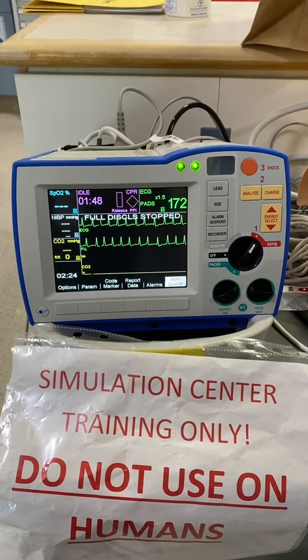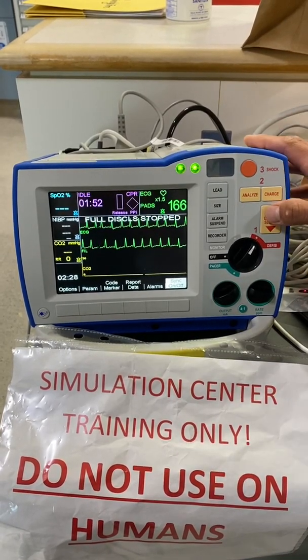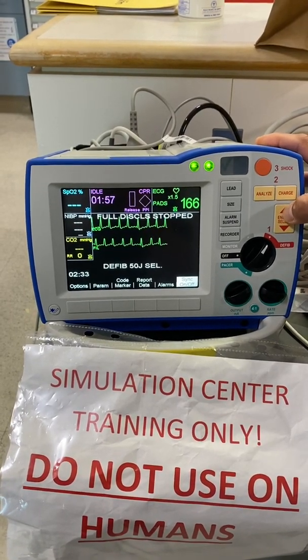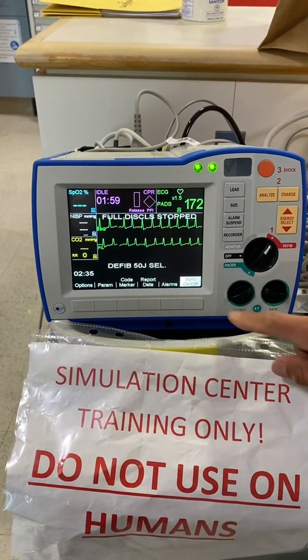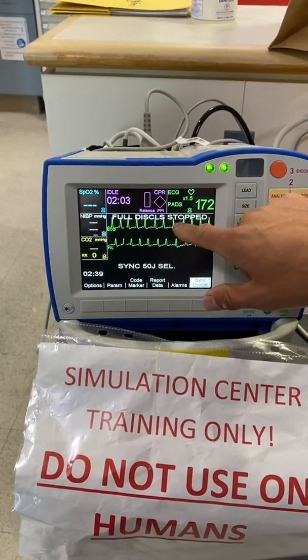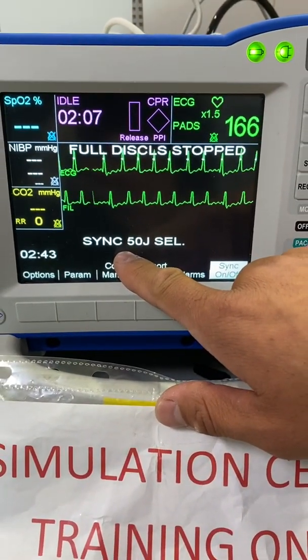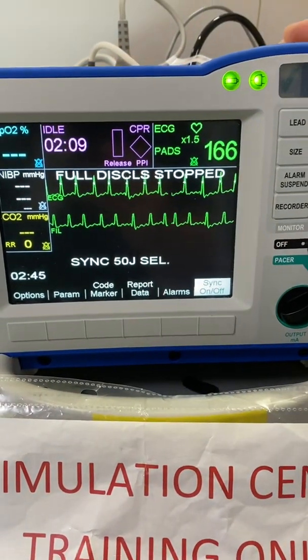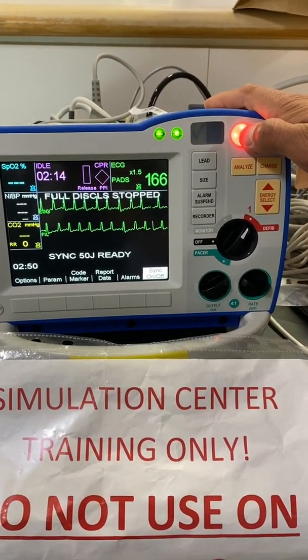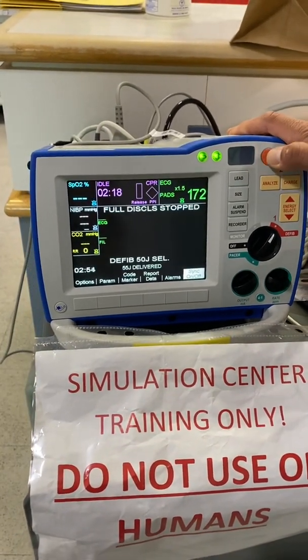So if we need to cardiovert, it's already set to manual defib. We're going to set it to 50 joules using the energy select button. I'm going to synchronize — press the sync button. You see the tick marks here in the QRS, and it also says sync right here — that's how you know it's on. I'm going to charge, verbally and visually clear my patient. Everybody clear. I'm looking at the patient as I press the button. So I shock.